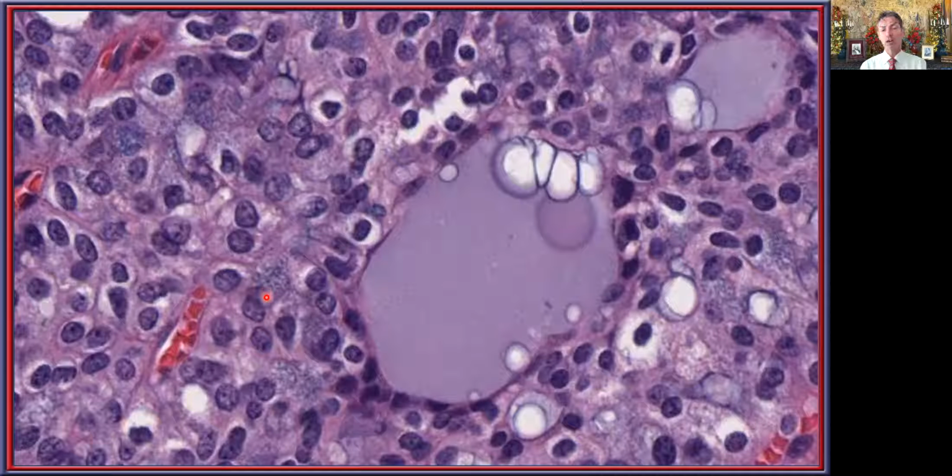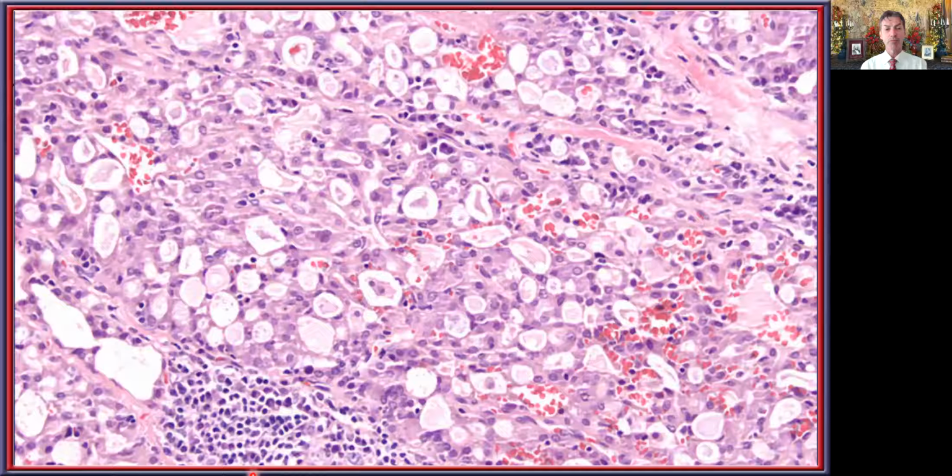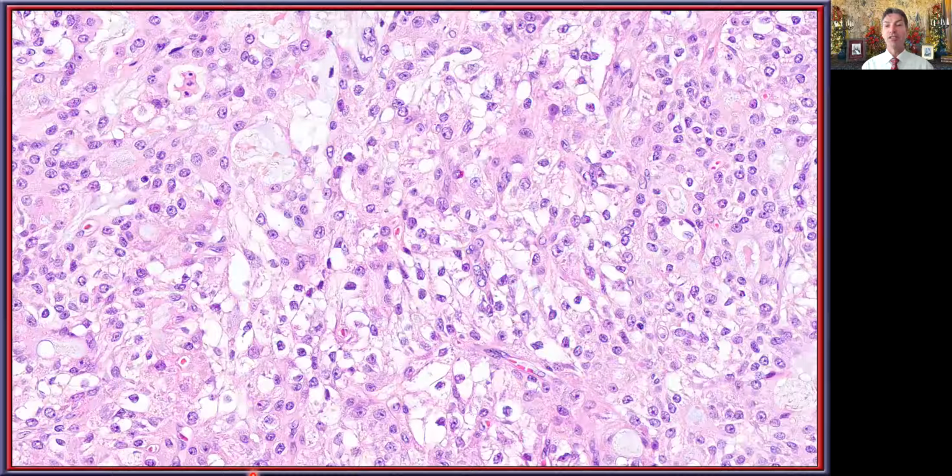But now not every one of the neoplastic cells has that particular feature. And if I go here to the non-specific glandular cells, it's a nice glandular appearance. But if this is all you had, I think you'd be very hard pressed to at least consider an acinic cell carcinoma. And perhaps if this was the cell population you had, which is now the clear cell dominant finding, and if the entire tumor had this clear cell morphology, I think it would be very difficult again to say, is this an example of an acinic cell carcinoma? So it is an important consideration to be able to say, what is it that I'm dealing with?